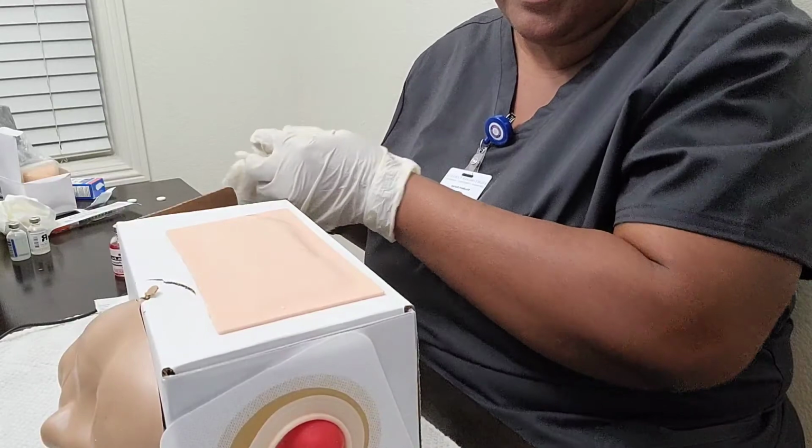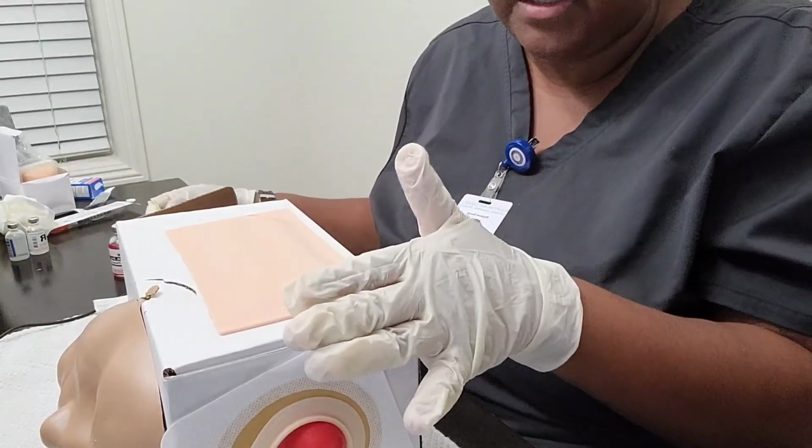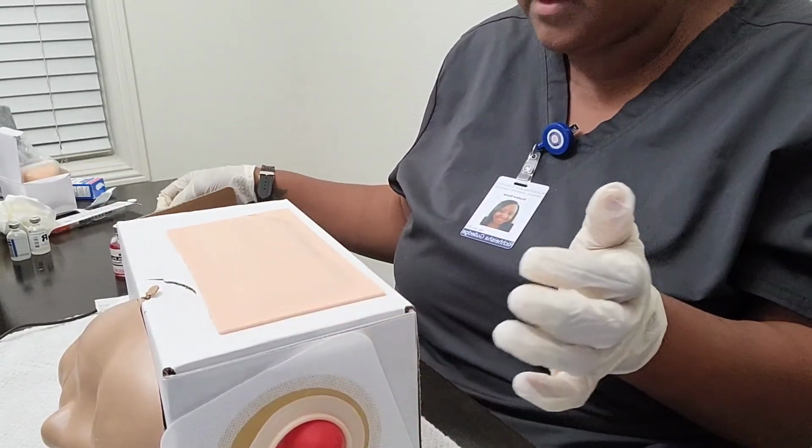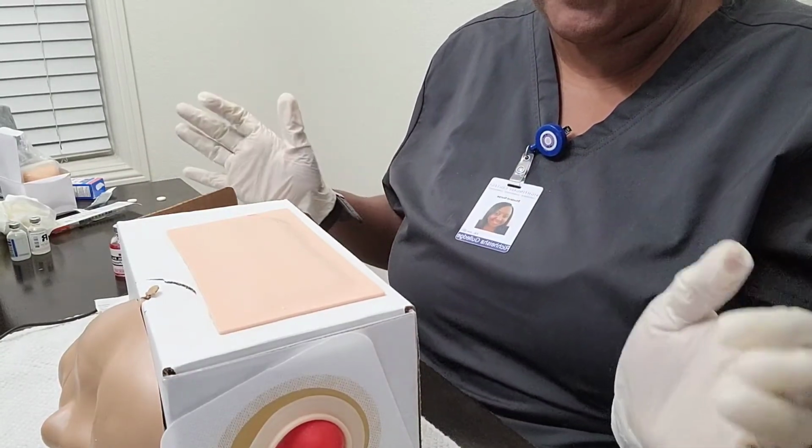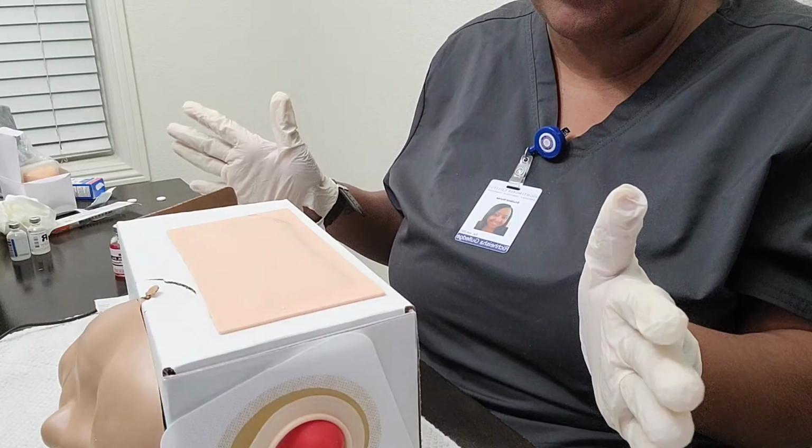Okay, and then I will allow this to dry on its own. I won't blow it or anything like that. I will allow it to dry.